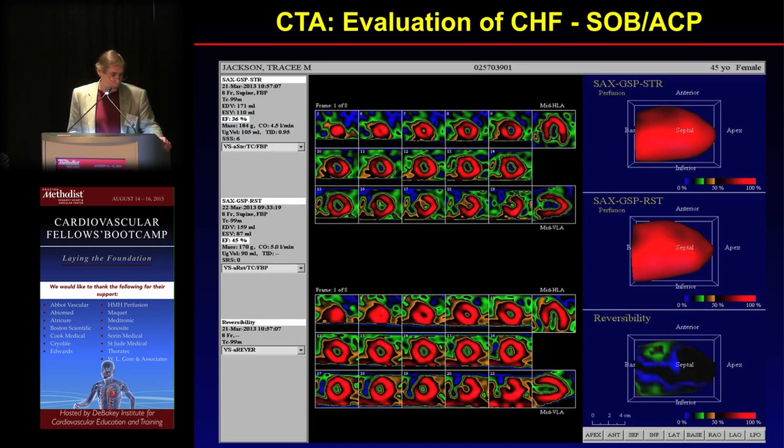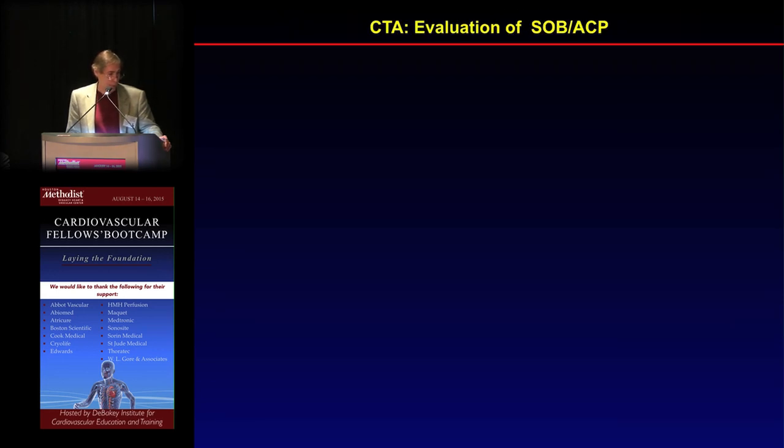Her ejection fraction was not normal. As you can see here, her ejection fraction post-stress was 36%, and at rest it was 45%, and because of that, we sent her for a CT for better clarification.